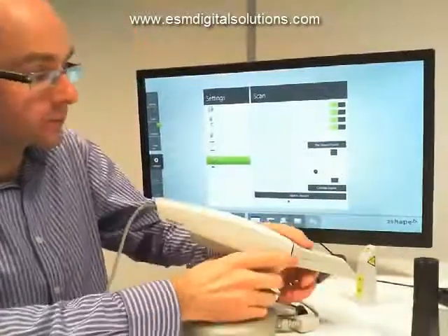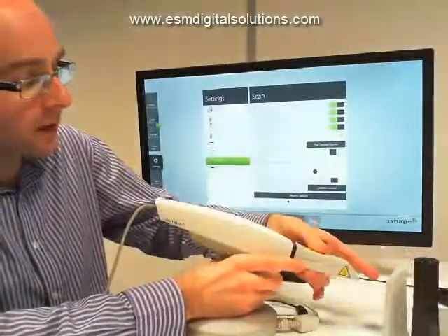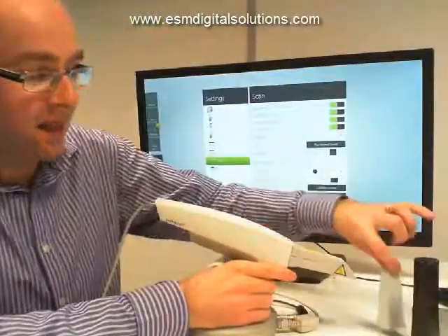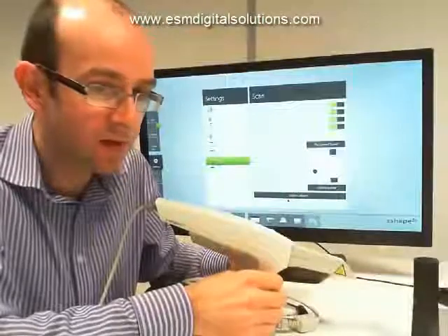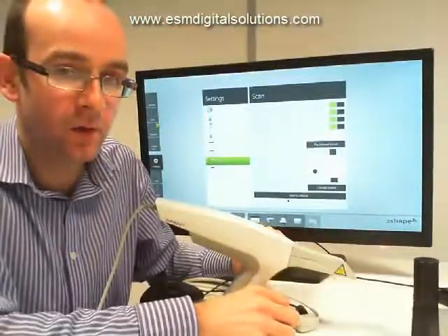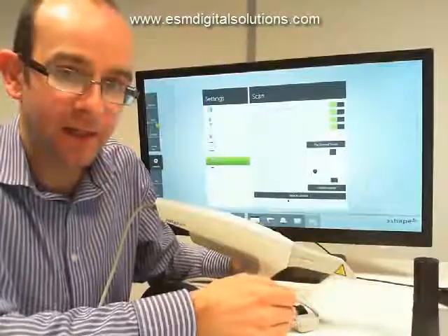That's a little introduction to TRIOS. Since we're not using it now, I'm going to put the protective tip back in place and that scanning tip will be sent off for sterilization. I hope it was useful — a little introduction to TRIOS, how it works, and some of the physical features of it. We've got plenty of other clips to show you in relation to actually using it and getting the best results out of it.